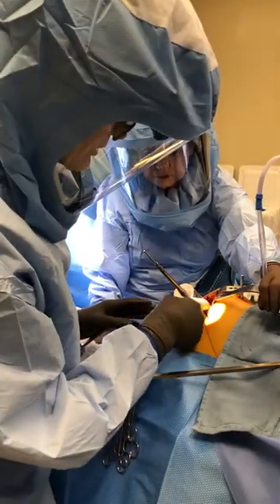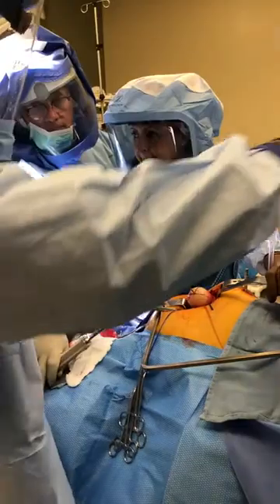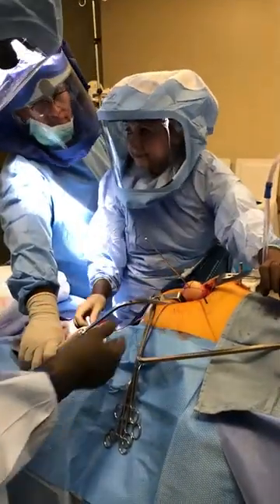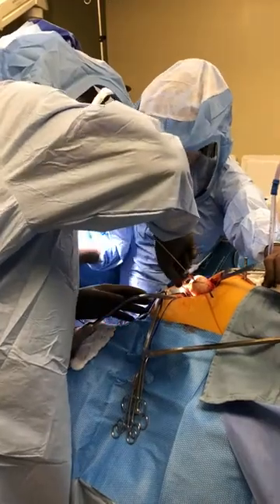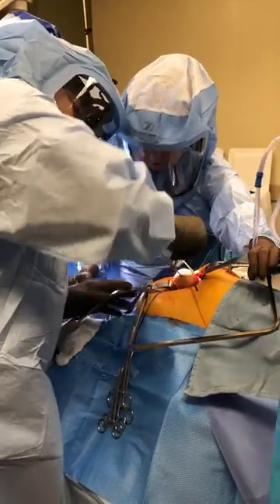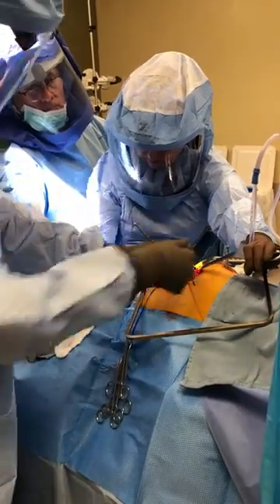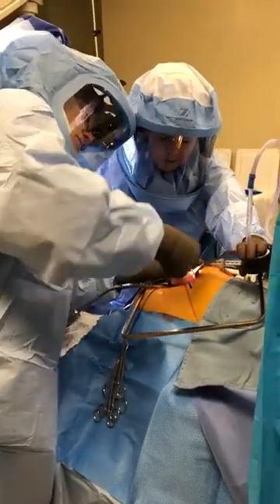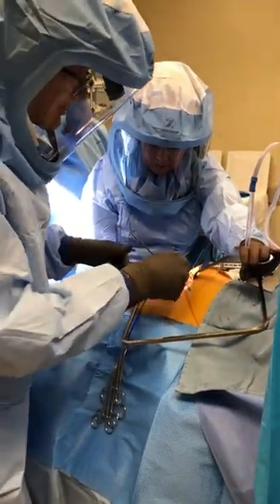I still like just taking a few off the top and more off the bottom because it avoids that neck notch. I'm just going to do one final check with the feeler to see where the blade comes out. I tilted it this way so I should have more clearance back here, and the superior and inferior should stay about the same.